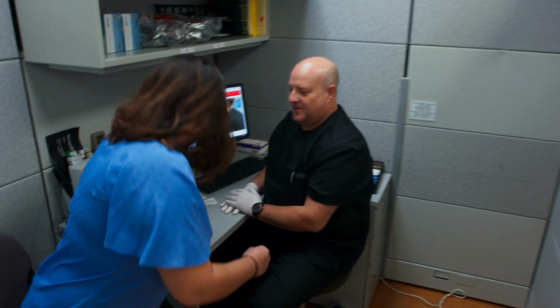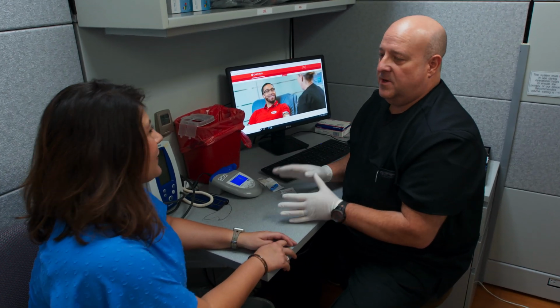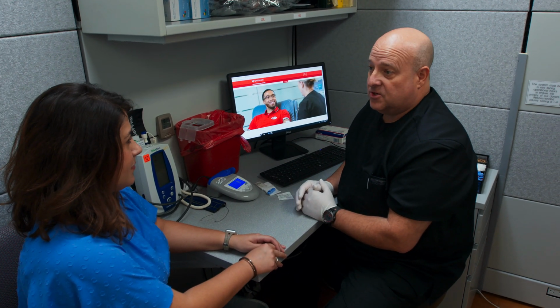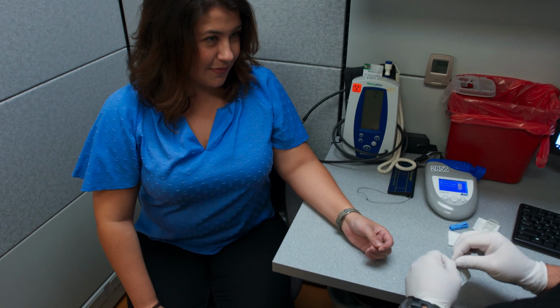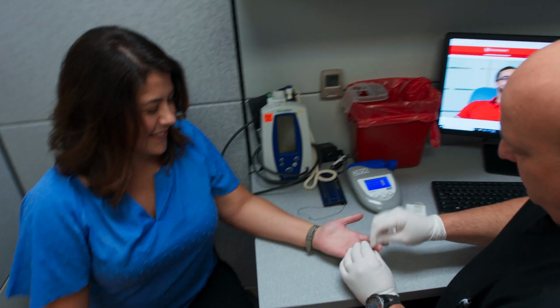Hello. Hi, how are you? Good, how are you? I'm Kenny. I'm going over your information with you. We're going to be doing a little mini physical on you, getting your blood pressure, sticking your finger, and we're going to check and make sure you have enough red cells to donate today, okay? Okay, perfect. Let's see your arms, please. Excellent. First thing we're going to do is a finger stick. Is this finger okay to use? Yes.